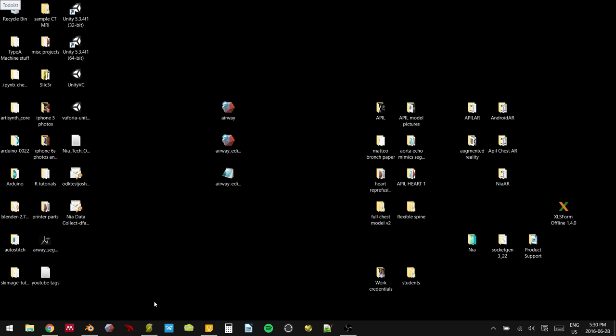So for our slicing, we're going to do it for any 3D printer that can read a .g code file. In the Mandible tutorial, we sliced it for a MakerBot, which takes a .x3g file type. For this one, we're just going to slice according to a .g code 3D printer. And this will encapsulate your Ultimakers, your Deltas, and of course the TAZs as well. The TAZs, which we run in the lab, read .g code files. There's a bunch of different programs that you can use for this purpose.